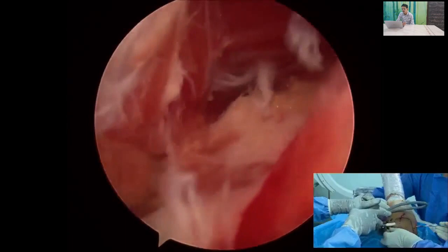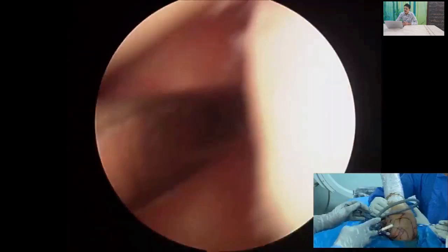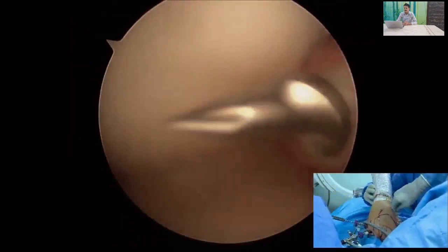Once you do a thorough release, you should see the subscapularis muscle belly. These muscle fibers must be visible. This is the tissue in which we can see the capsulolabral complex, and the humeral head is still displaced.